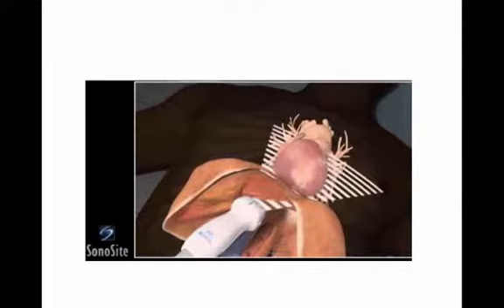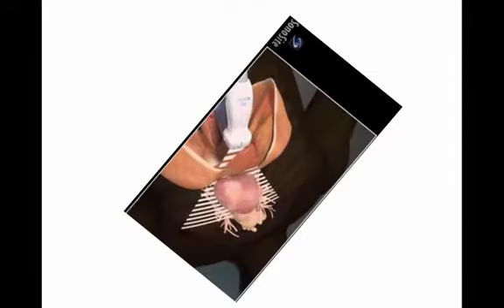Let's try to understand that spatial orientation by using stylized diagrams provided by Sonosite. In this diagram, you can see the probe here. It emits a beam, which is here. You can see that the plane of the beam intersects the liver first, then the heart. How is this displayed on your ultrasound screen? Well, if you rotate this image so that the ultrasound beam is at the top, you will begin to understand the orientation that you see on your screen.